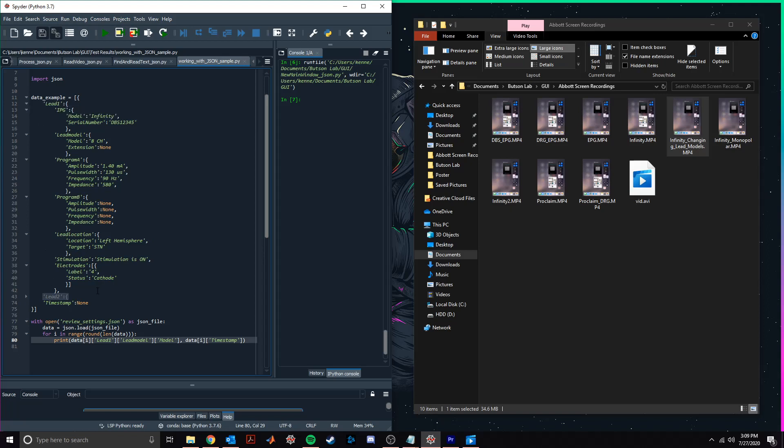We can also pull specific information from our file using these lines of code at the bottom of the script. As an example, I'll change these indices so that we can take a look at amplitude data stored in program A for lead 1.